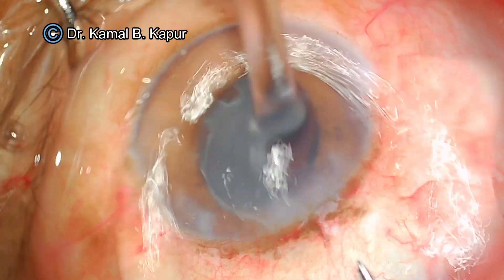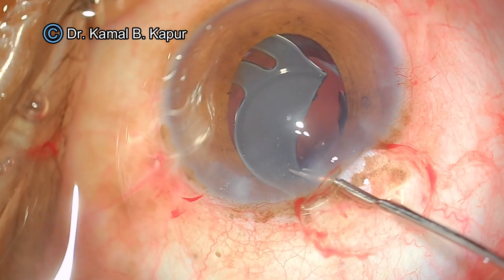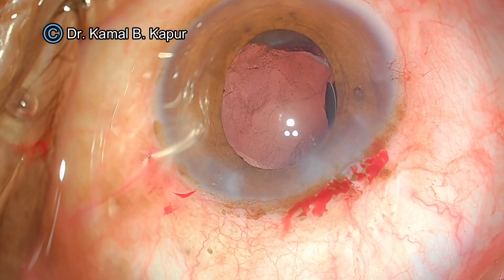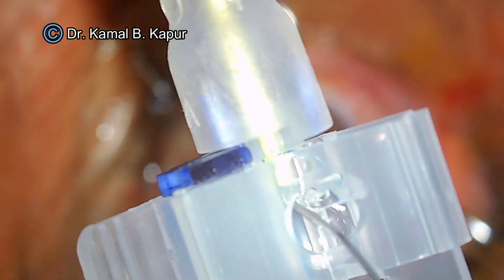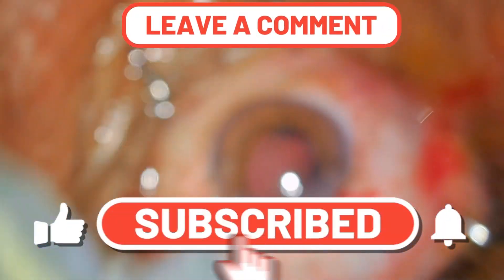The next piece will also be brought out by pulling with the forceps. All we need to do is use the forceps to remove the remaining part. You will notice that the small cut flange part of the haptic that was cut from the optic is still lying in the capsular bag, but it is not going to bother us.